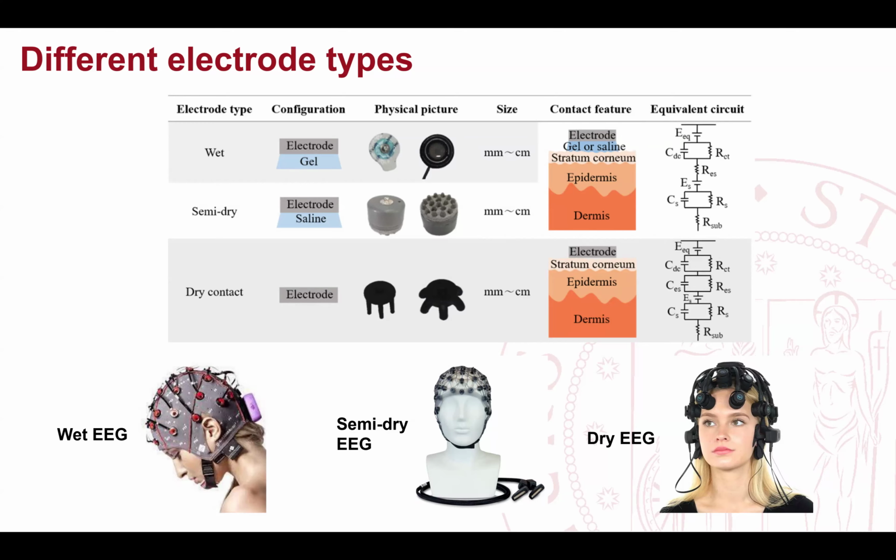So saline can also be the powders for the babies. It's okay. I used the saline solution. Yes, exactly, but it was difficult when the subject has a lot of hair. Which system have you used? Emotiv. Okay. Yes, with the semi-dry. I would say that I also didn't consider that technology till now because they also had these kinds of problems and they were almost working as a dry EEG. So I didn't like them that much.